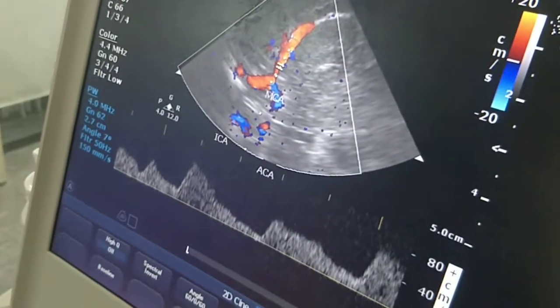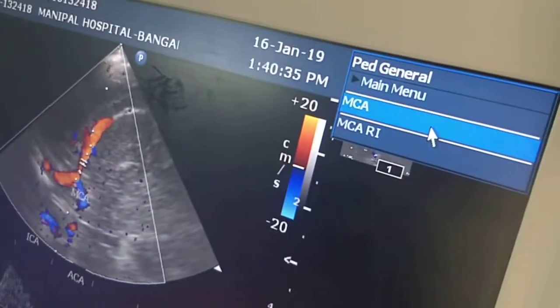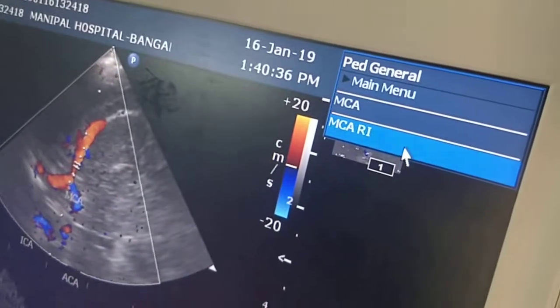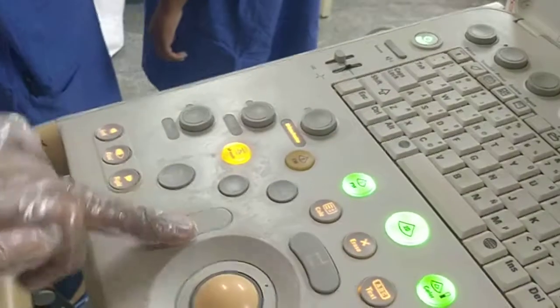If you want to calculate, this is MCA. Go to RI — I'll click this button, you can see this button.